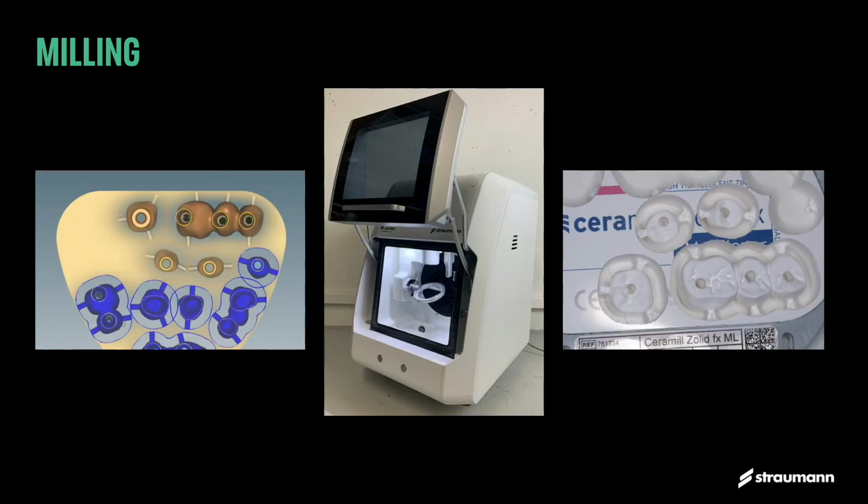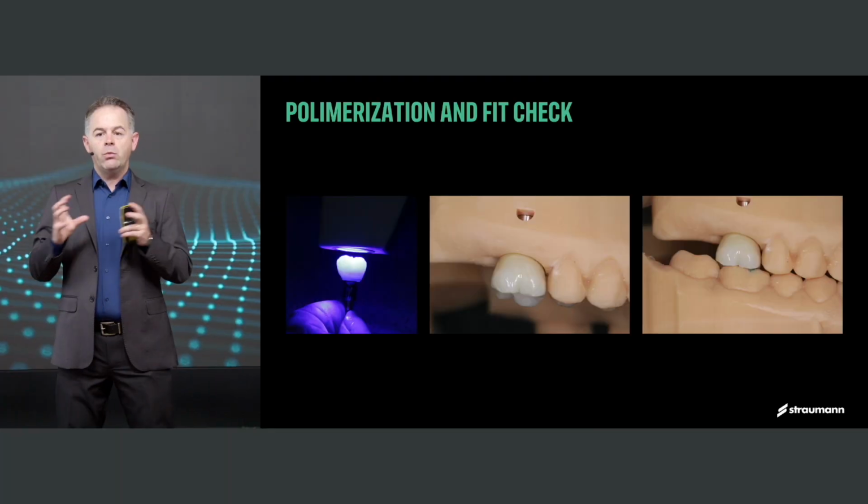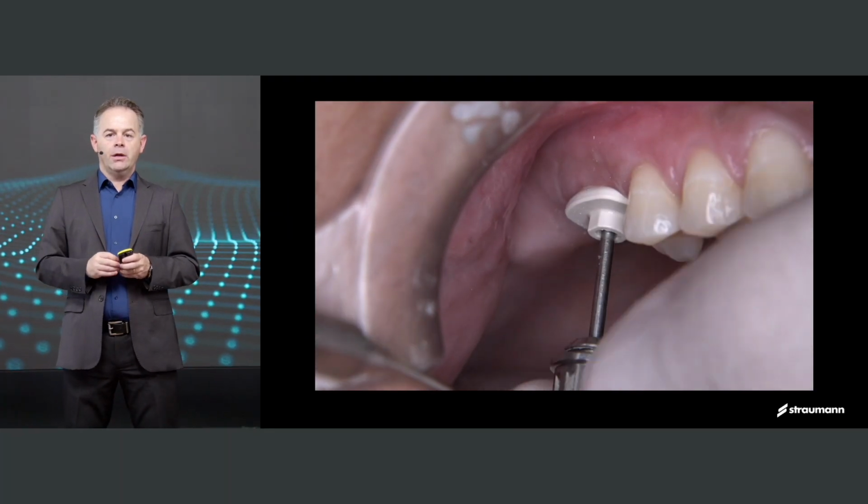As we shift that design to the lab, during scanning, what you also do, you take a picture with your shade palette. In this particular patient was A2, A3, and A3.5. This was shifted to the lab technician who started doing the artwork of the shading to best match the patient's overall coloring. All the lab work is done. It's time to get real.